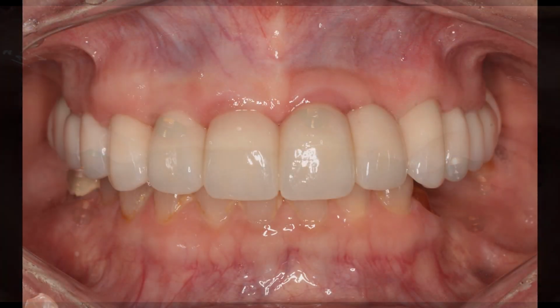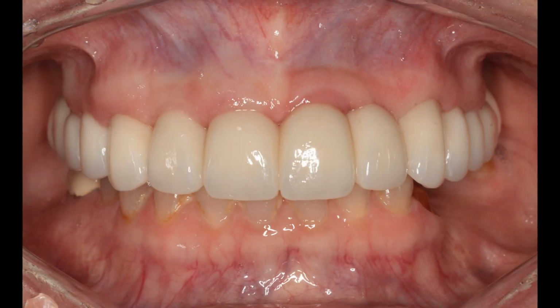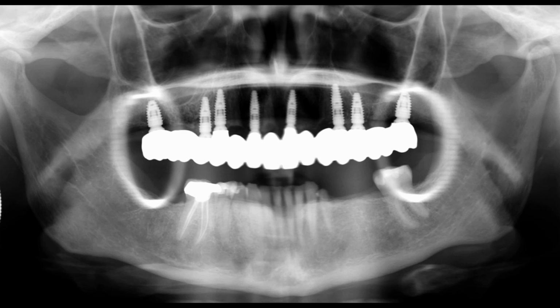Here is her final restoration. Here is her final panoramic x-ray. Sorry about the earrings. Every once in a while my assistants forget to have patients take out their earrings and they superimpose on the teeth. Those are just hoop earrings, nothing pathological.